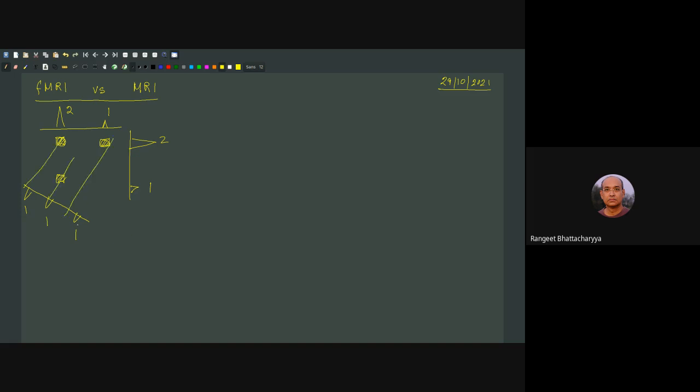From this information you can reconstruct and find out the images. Suppose you had no clue about what is there and you are only given the spectra.